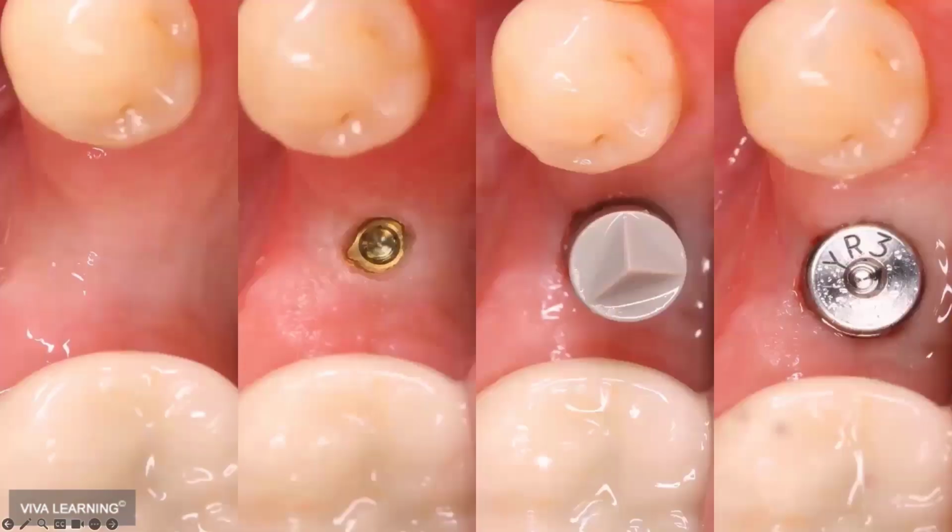Okay, so let's get into some implant stuff that you guys might see. Whether you're doing implant surgery or not, if you're restoring it, this is great because you can actually do part of the first stage implant surgery. I'll use my laser to do a crestal incision and, for the implant placement, do the initial punch cut through the cortical bone with the laser.